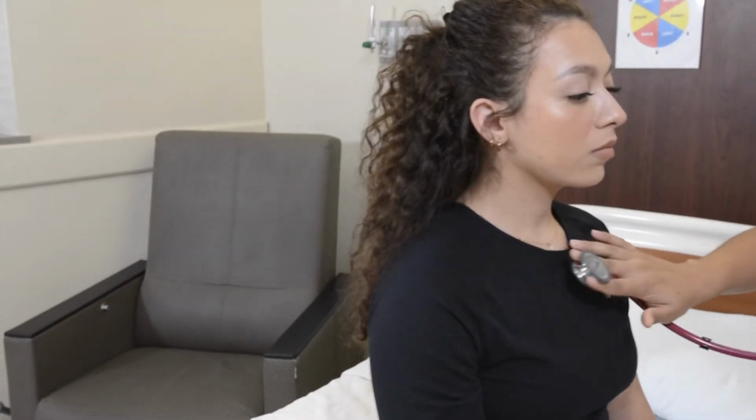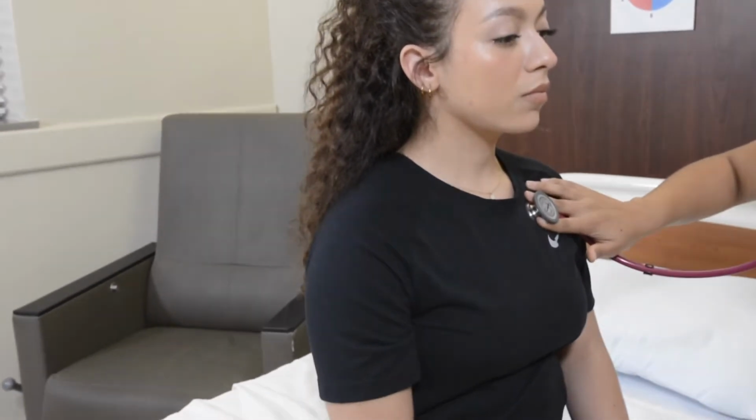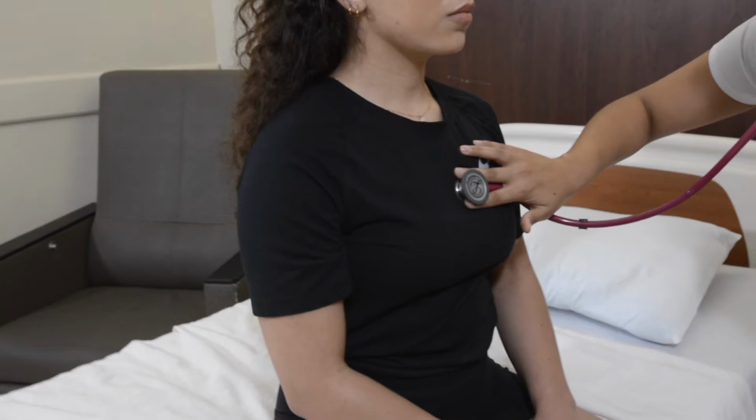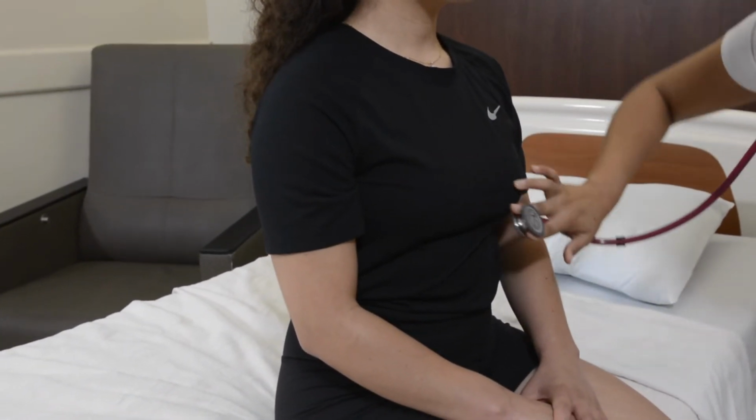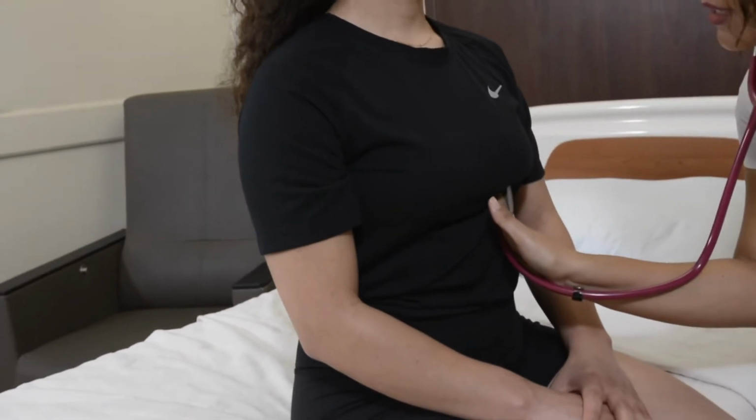Aortic, pulmonic, Erb's point, tricuspid, and mitral area.